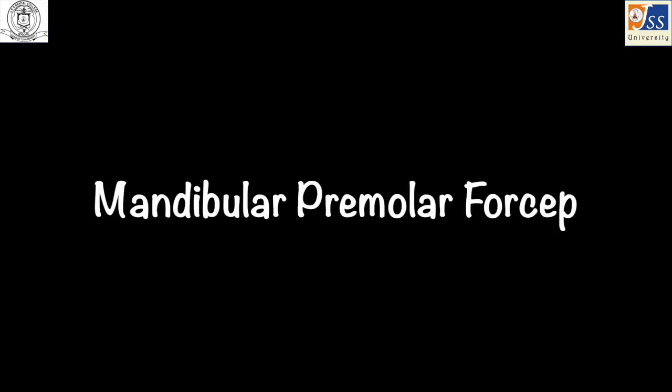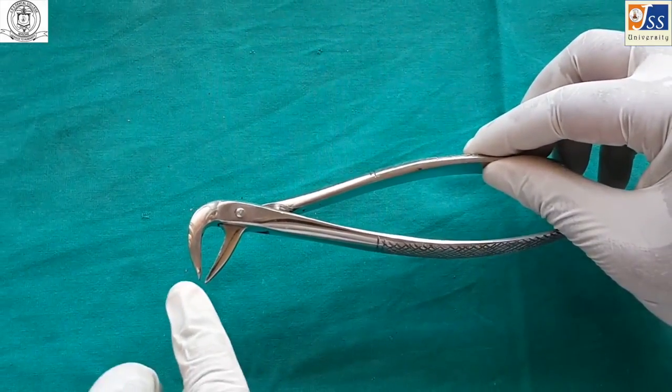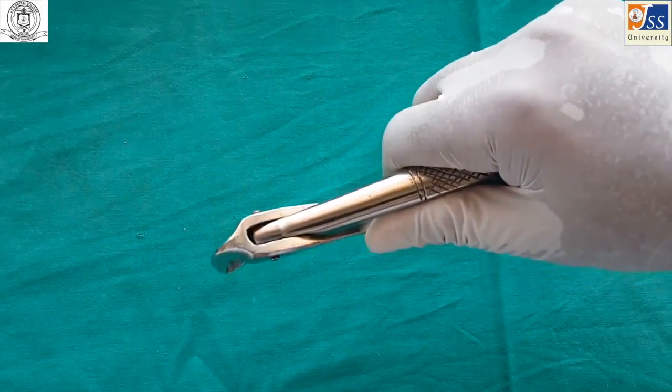Mandibular premolar forceps is used for the extraction of mandibular premolars. It is much similar to the anterior forceps, but the beaks do not come in contact.